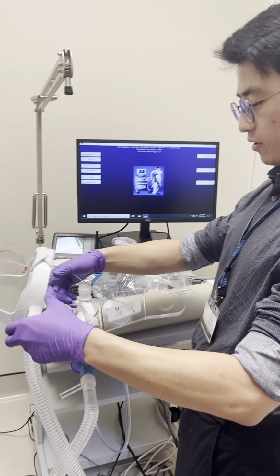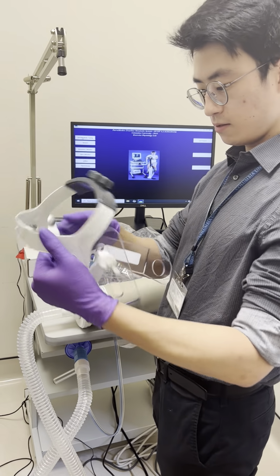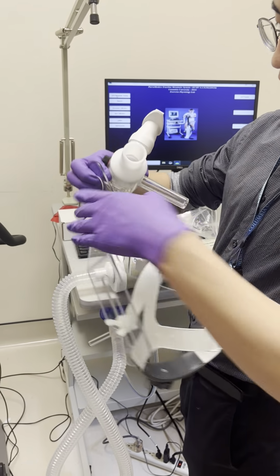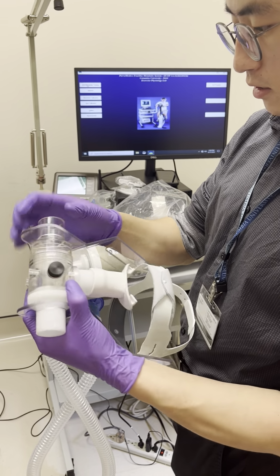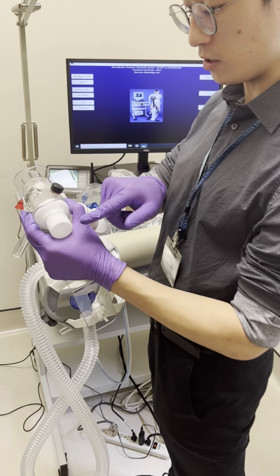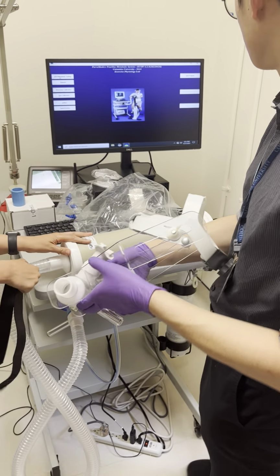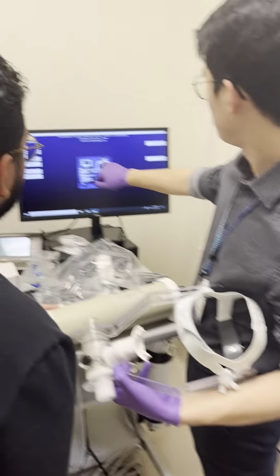All right, so this is the very unruly headgear. So the way it works is one end goes in here, and the other end goes in here, and this is the end that connects to the hose, right? I think it's the white plastic one. This one says it's the clear one. Right. Well, I guess we're gonna use the wrong one.